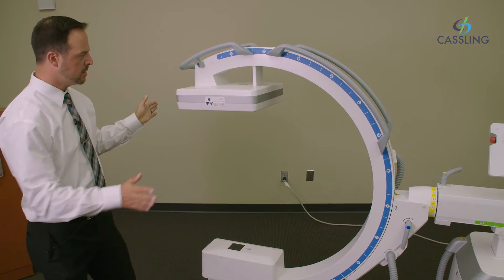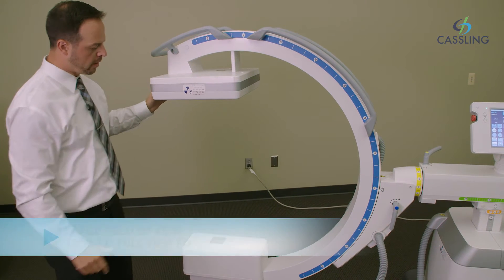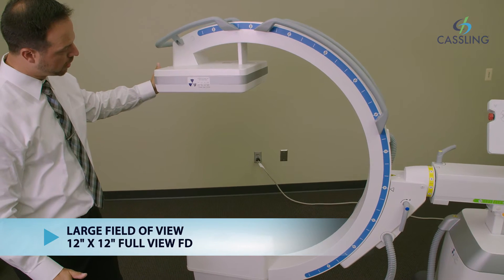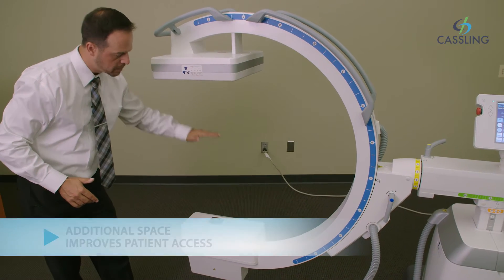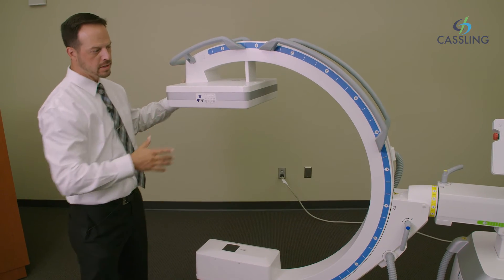It comes in two different sizes. This is actually a 30 centimeter by 30 centimeter, which is a 12 inch by 12 inch, or optional is a 20 centimeter by 20 centimeter, 8 inch by 8 inch. By doing that, you're also going to get a couple more inches of free space in the C-Arm itself, as you're eliminating the image intensifier of the C-Arm.